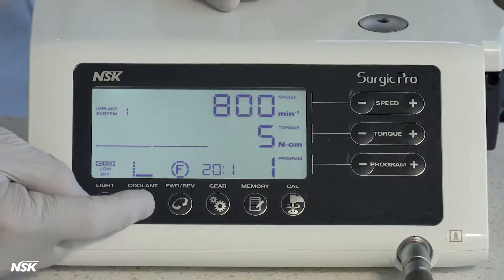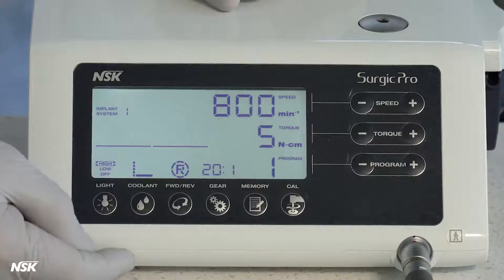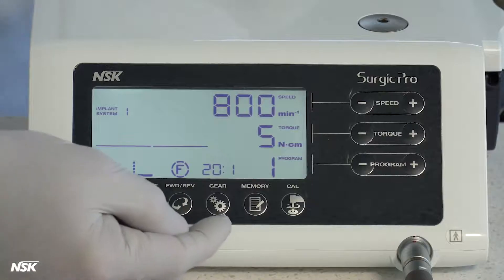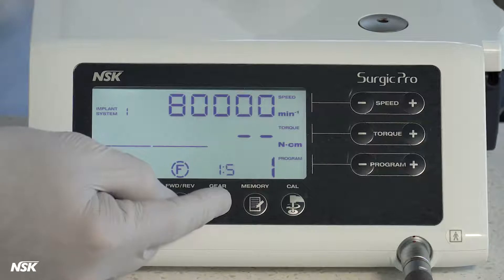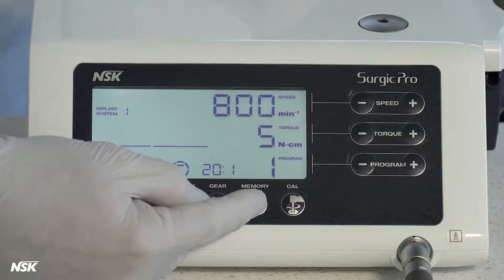Coolant flow button adjusts the level of coolant and can be set up to six different levels, which includes no water flow at all. Forward/reverse button changes the rotational direction of the micromotor. Gear button selects the matching ratio for your different attachments — for example, 20 to 1 for implant contra angle. Memory button is used to store the parameters of a custom setting in a program. After choosing the proper speed, torque, gear ratio, forward or reverse, and coolant flow, simply press the memory button for two seconds until you hear a beep to store the settings.